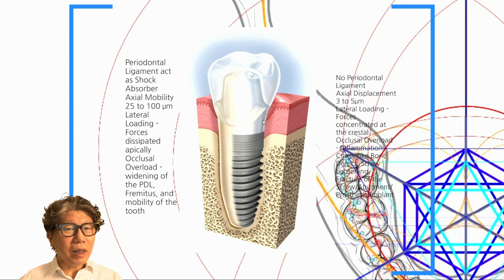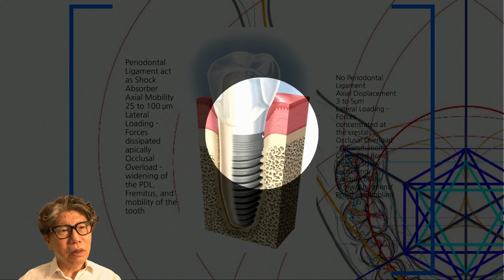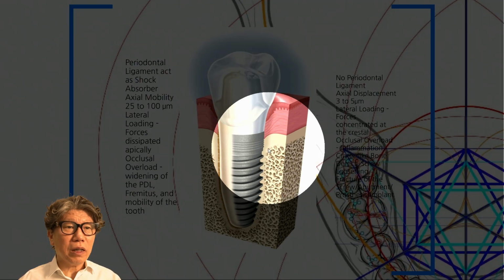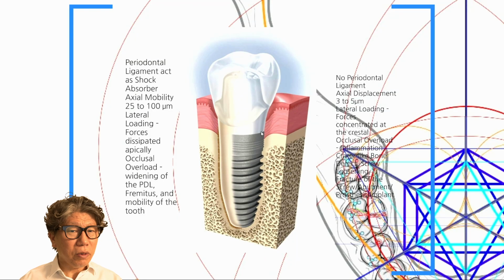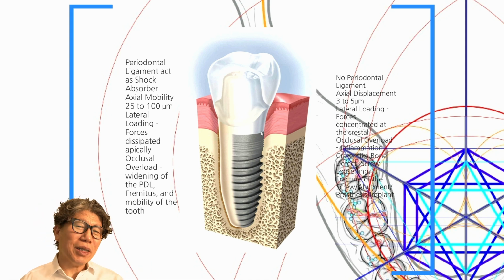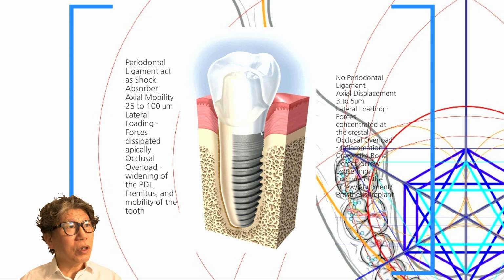However, the reason this product did not last long is that the parts kept breaking down every 3 to 6 months. So patients had to be called in every 3 to 6 months to replace the parts. The bigger problem was that despite this, crestal bone loss or surrounding inflammation occurred. So this product vanished into history and no longer exists. It seems like they didn't do such things anymore. This product came out when I was in the military, so I wanted to go to Germany to learn this, but at that time, soldiers were not allowed to go abroad, so I still remember feeling a bit regretful.